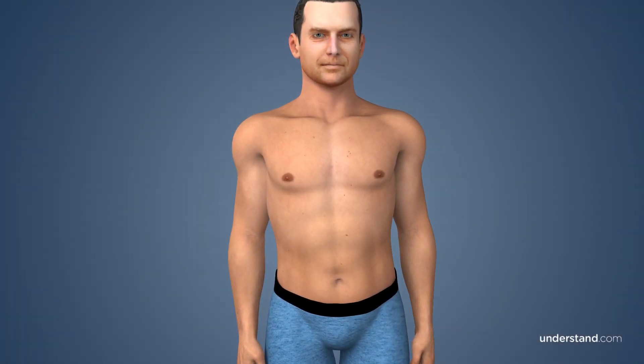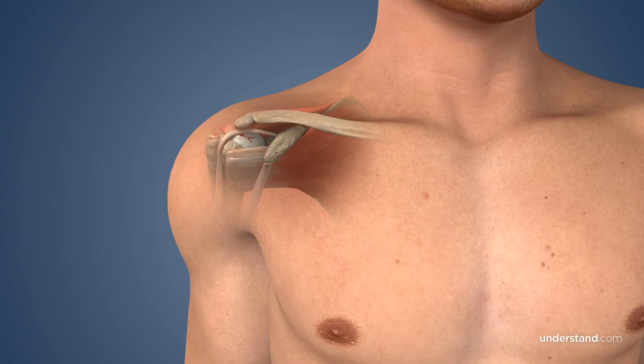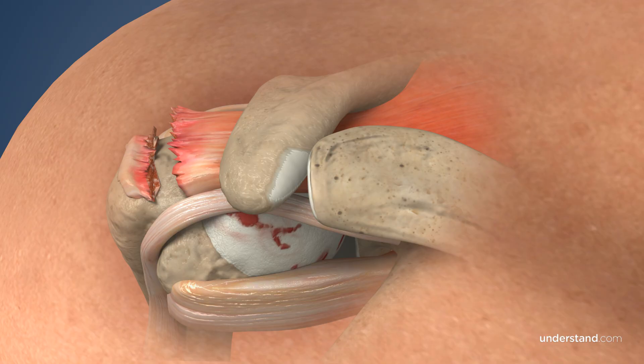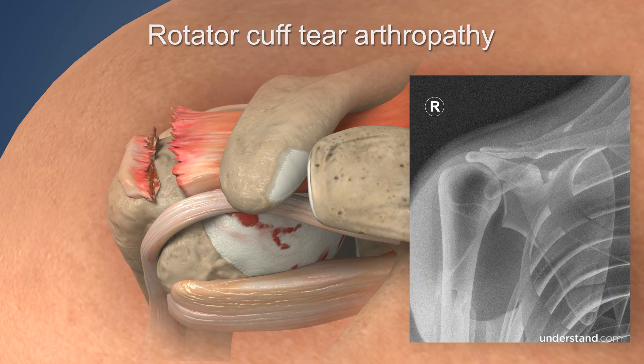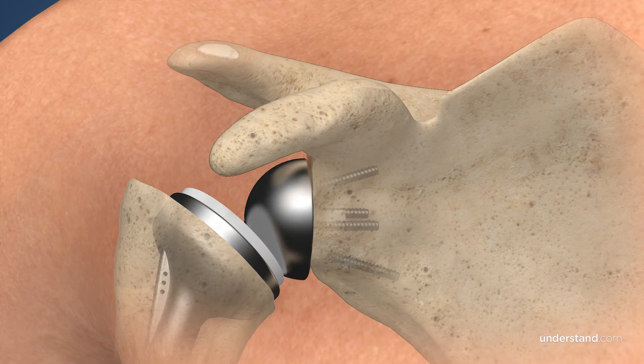Reverse total shoulder replacement is a surgery performed to improve shoulder function and decrease pain. This procedure is performed on patients who have suffered massive rotator cuff tears, which have led to a painful condition known as rotator cuff tear arthropathy, or on those patients who have undergone previously failed shoulder surgeries. The surgery removes damaged portions of the shoulder joint and replaces them with a prosthesis.